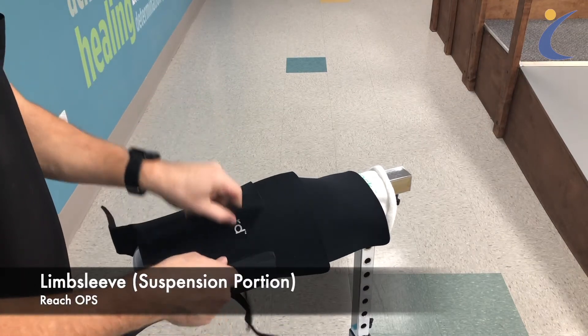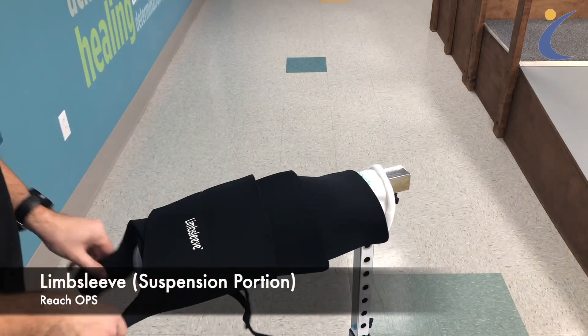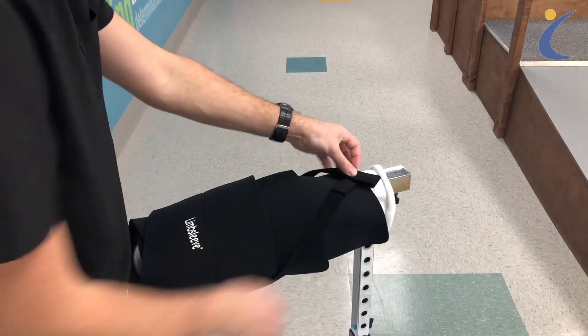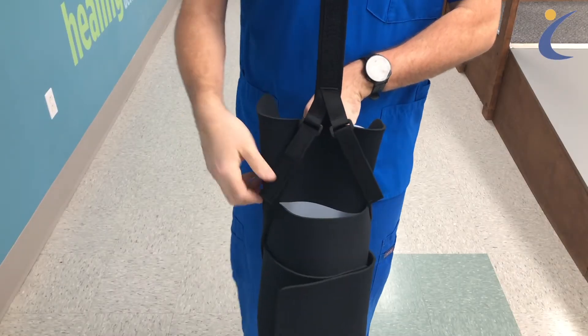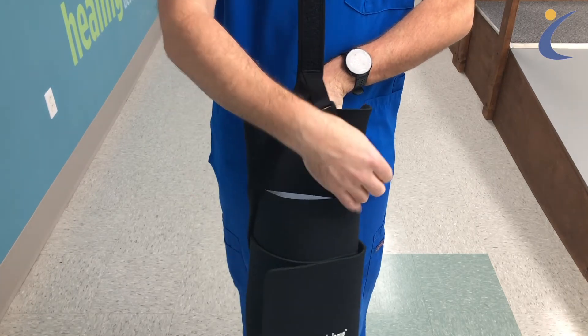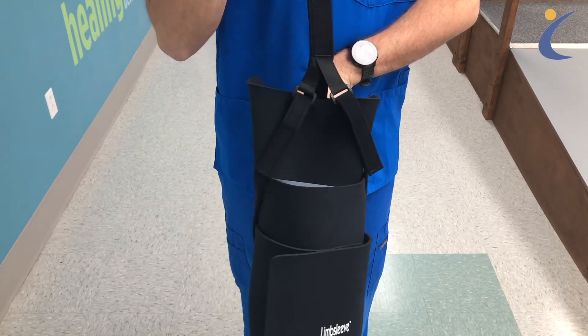The limb sleeve should be used whenever getting up and moving. Wrap the material around the protector and secure the Velcro at the front and bottom. Pull the straps from the back across the front. These straps are then tightened against the buckles attached to the waist belt. Secure them in place to ensure proper suspension of the device when standing.